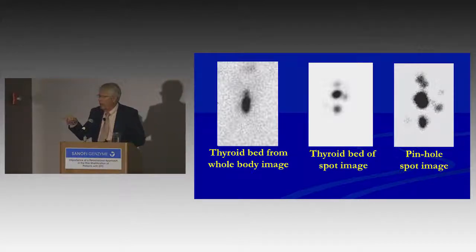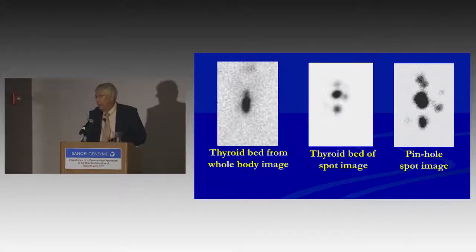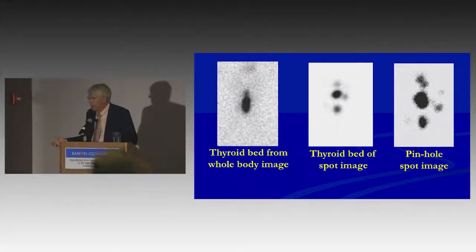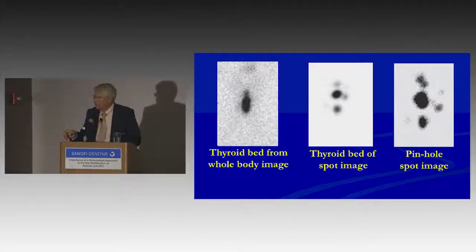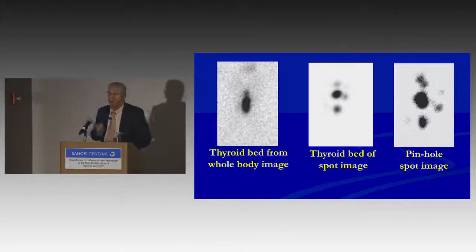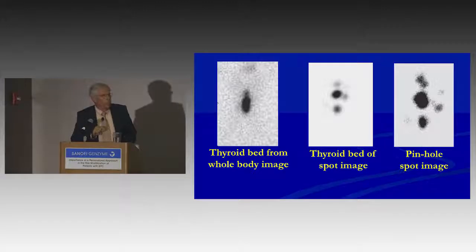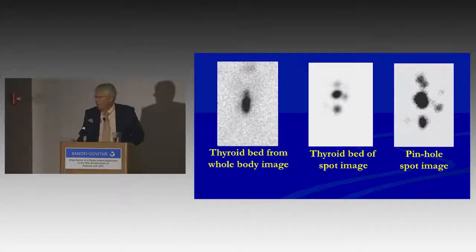This image on the right is from the same patient, same day, same camera, but has a pinhole collimator on it. Now, I'm not going to take the time, because we have limited time, to go into the dynamics and physics of a pinhole collimator, but a pinhole collimator has the highest spatial resolution of any imaging within nuclear medicine other than PET. And that information will alter management. There are many other techniques, but I just want to emphasize this one here.